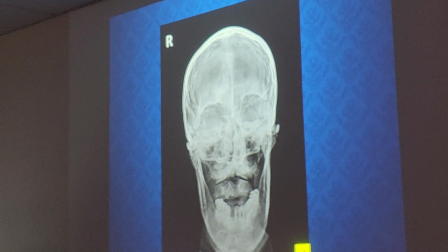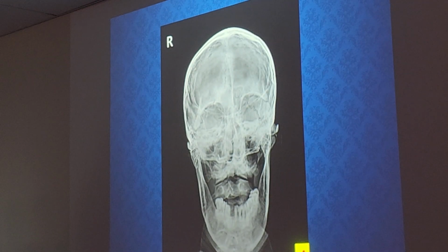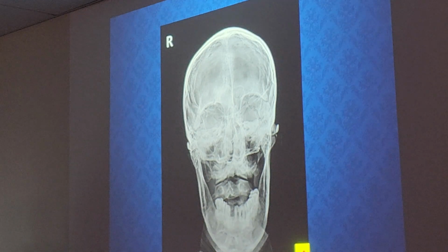Oh, this is a skull. They just open their mouth, but what's the confusion? What is this? AP open mouth, but we do open mouth AP. We do everything. This is open mouth AP.